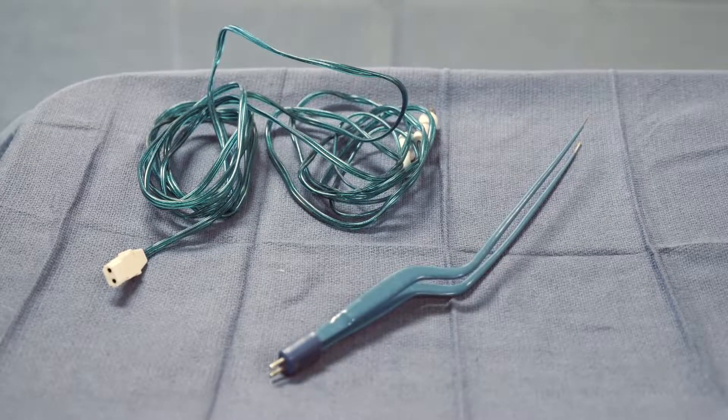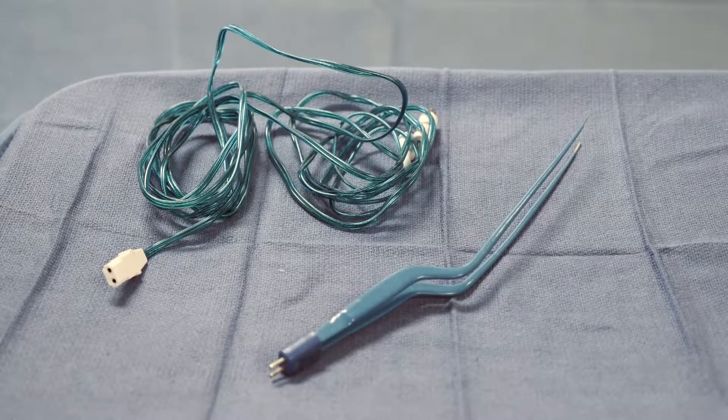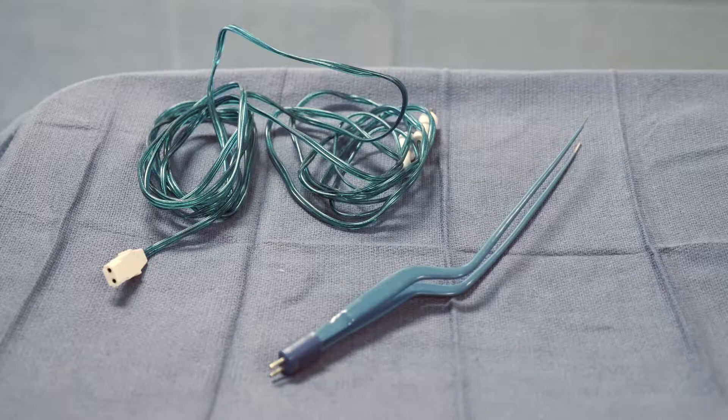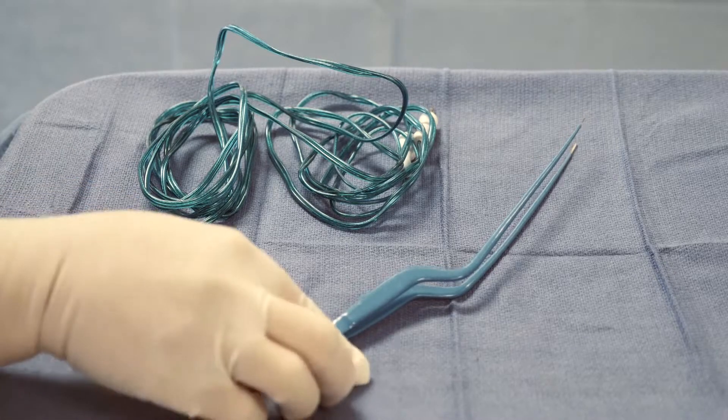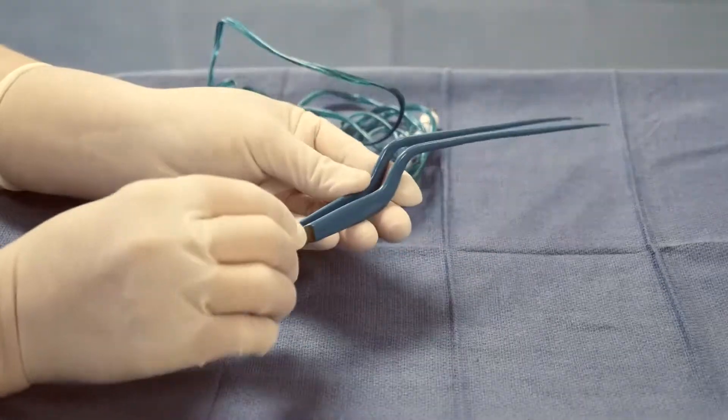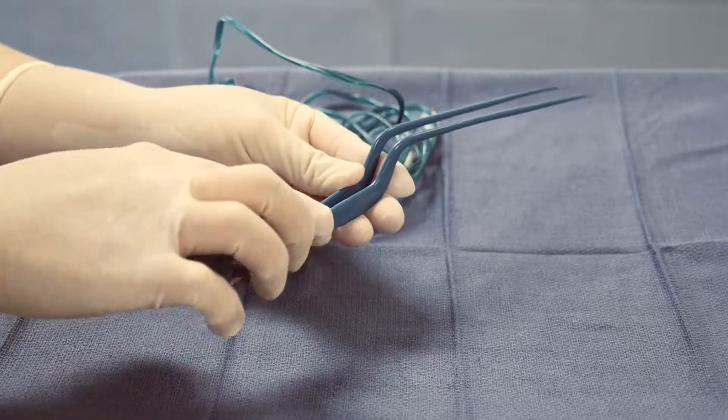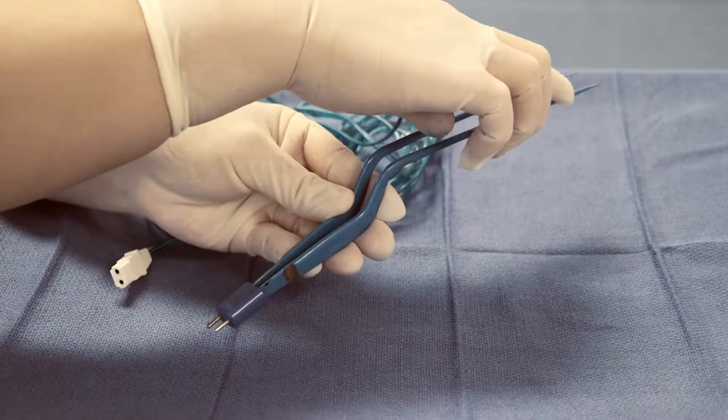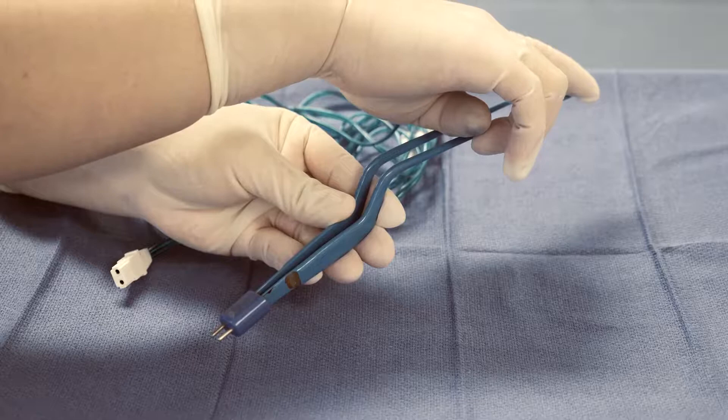This instrument here is called a bayonet or a bipolar forceps. Notice here how the forceps along the shaft is insulated. The insulation stops at the tip of the instrument.